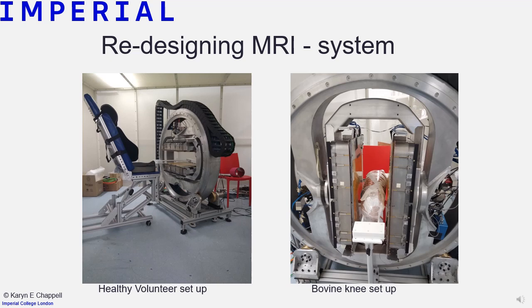And here you can see the magnet at 0 degrees, which is this sort of letterbox thing, which is our start point, and at 90 degrees of roll.